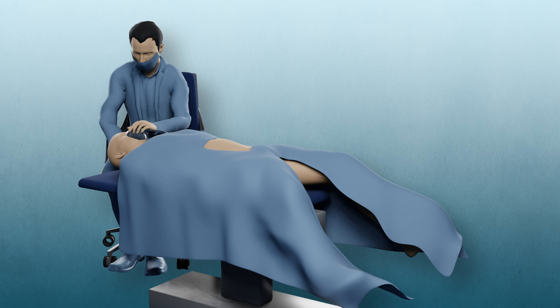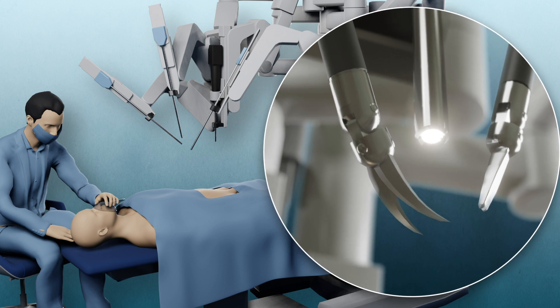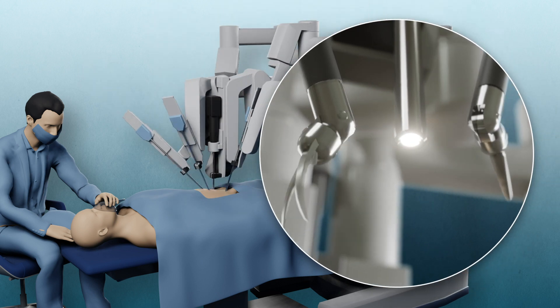RARP is carried out under general anesthesia. During a general anesthetic, medications are used to send you to sleep so you are unaware of the surgery. When you are fully sedated, small cuts are made in your belly. Surgical tools and a camera are inserted through these cuts.